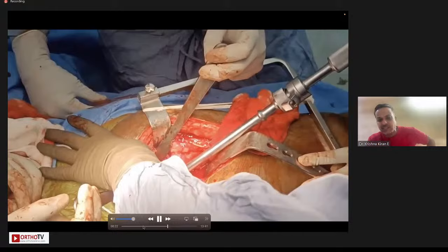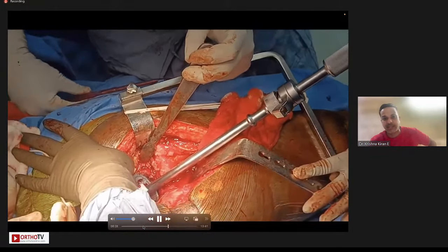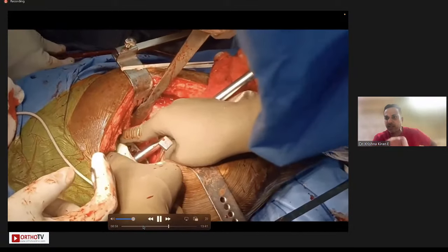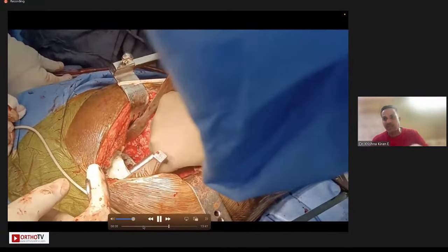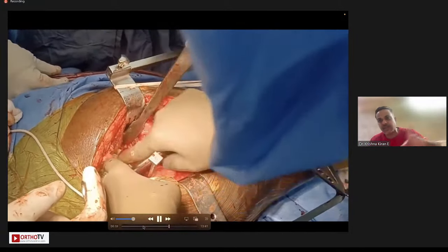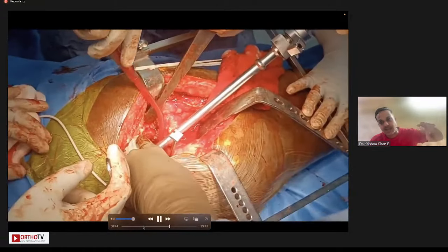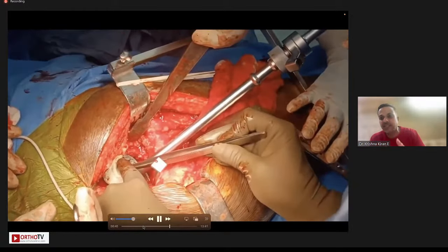Then once the cement sets, you know the position of the superior pubic ramus, which you have already identified. There you will make your drill holes, fix the cup inferiorly, and this will prevent abduction failure of the socket. Because you have inferior catching points, you have a superior cement mantle and an augment which has got host bone contact and screws going through the augment, this construct becomes really stable.